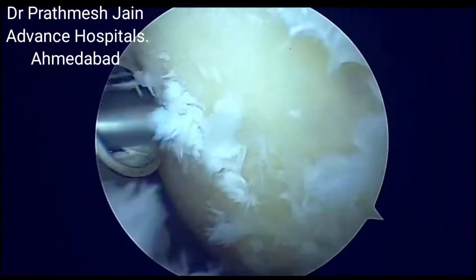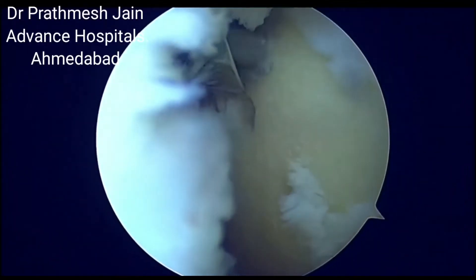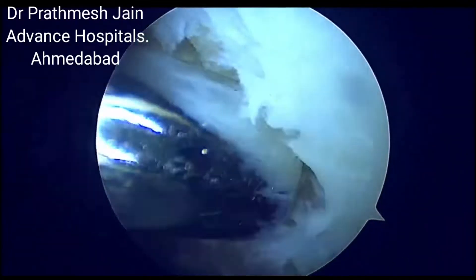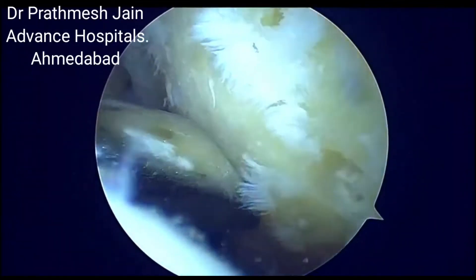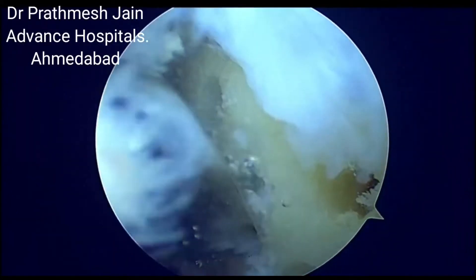If there is a cartilage lesion which is unipolar and there is bone exposed, that is the Outerbridge Grade 4. You can do a microfracture to increase the vascularity and it will form a fibrocartilaginous tissue instead of hyaline cartilage, but still there will be good results.